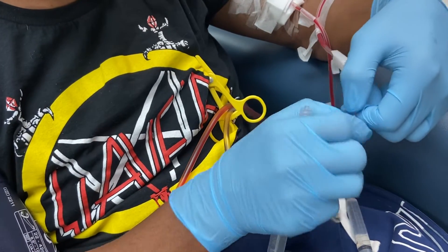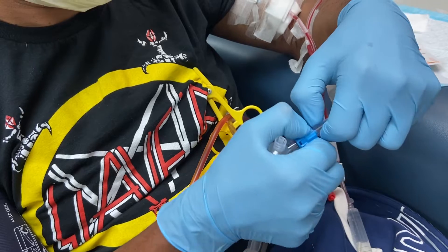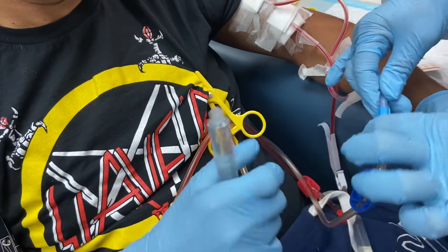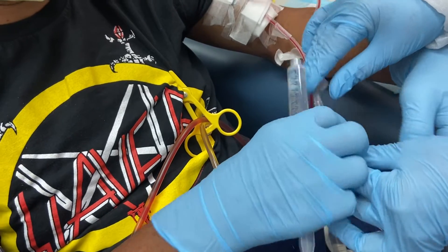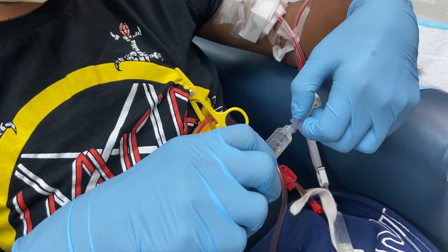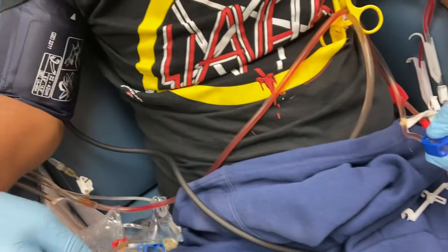You're twisting at the wrong spot. There. Now you're disconnected. Put back the lines to the saline bag.